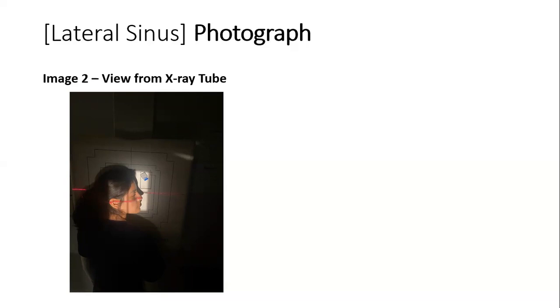The kVp range for a real patient should be approximately 75 kVp. Our instructions for the patient should be to hold still, not move, and not breathe.